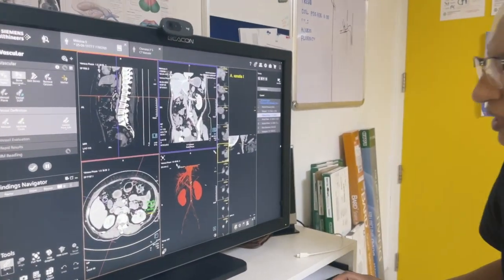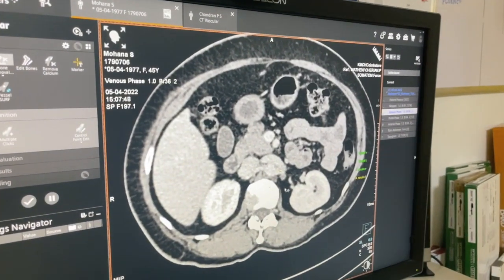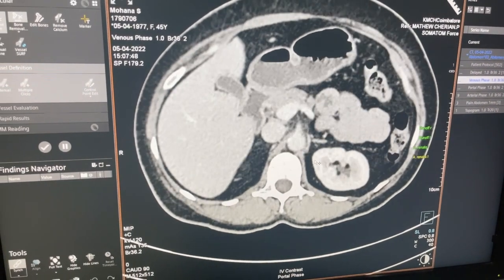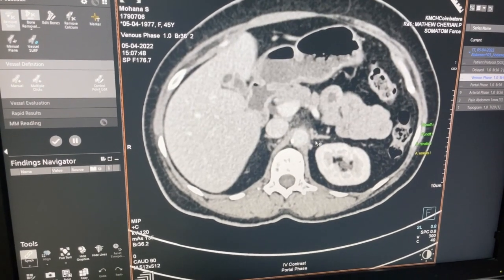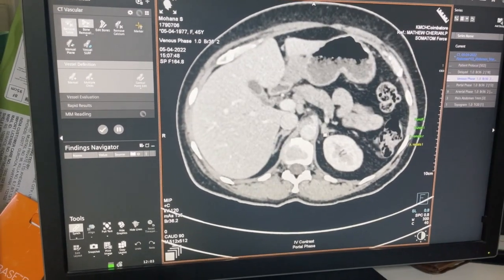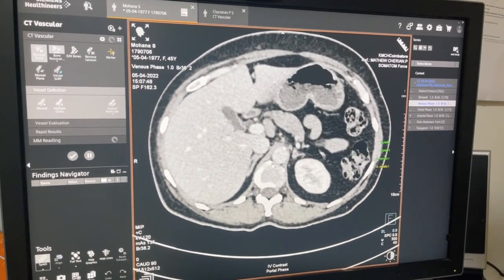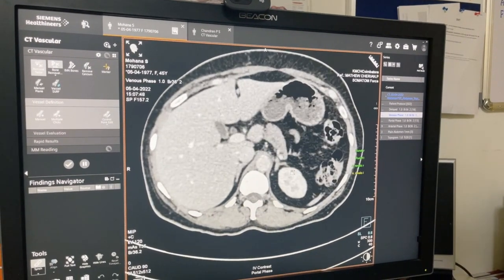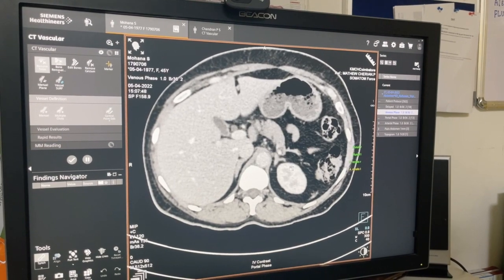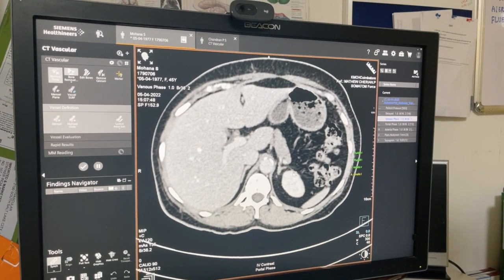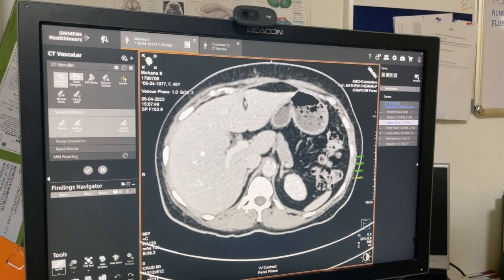Let's have a look at the CT of this lady. In many patients the adrenal glands will look normal. You can see the left adrenal and also the right adrenal — these are normal adrenals with no adenoma. Even if there is an adenoma, there is still an indication to sample, purely because it can be a non-functioning adenoma and you may completely miss the picture if you remove the normal side.